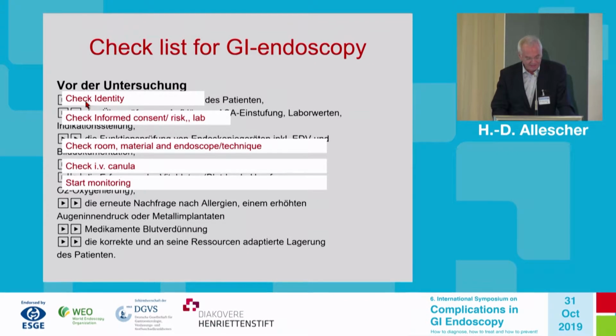Then you should start the monitoring. It should be clear who puts on the monitoring, who checks the monitoring. As you know, in Germany we have the NAPS sedation, so the nursing staff is doing the sedation during the procedure, but you have to make clear how the sedation process is started, because the start of the sedation is usually something which has to be done by the doctor, so it has to be defined when the monitoring starts, who does it, and how it is documented.